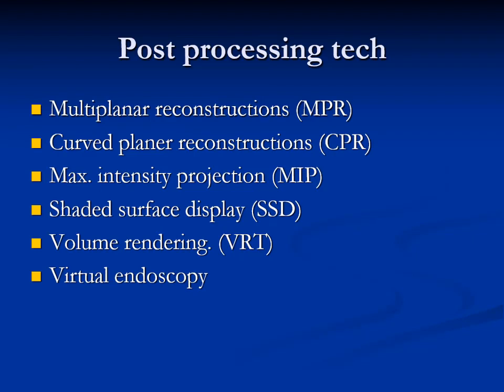Post-processing techniques: multiplanar reconstructions, MPR. Curved planar reconstructions, CPR. Maximum intensity projection, MIP. Shaded surface display, SSD. Volume rendering, VRT. Virtual endoscopy.